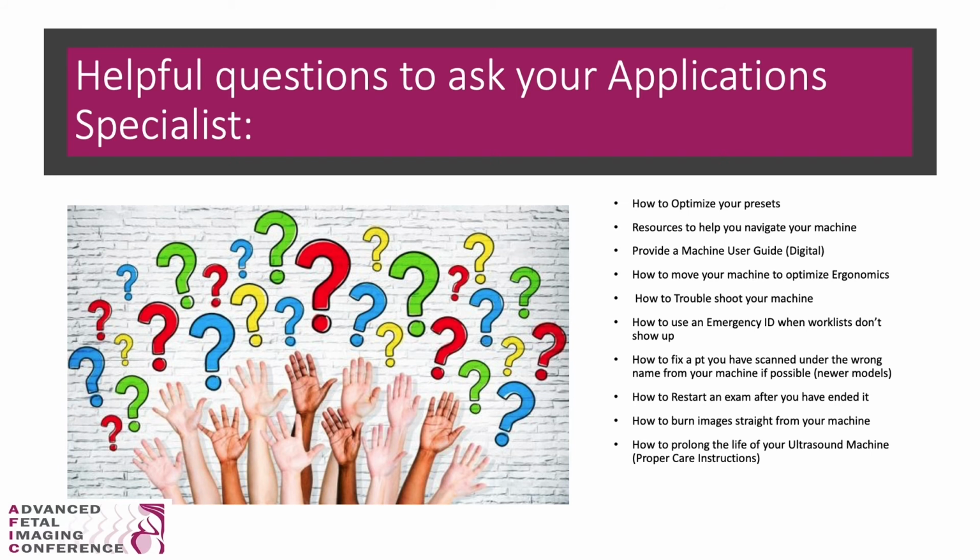Helpful questions include how to optimize your presets, resources to help you navigate your machine, ask to provide a user guide including a hard copy or digital, how to move your machine to optimize your ergonomics, how to troubleshoot your machine, how to use an emergency ID when work lists don't show up, how to fix a patient you have scanned under the wrong name from your machine if possible, usually that's with newer models, how to restart an exam after you have ended it, how to burn images if possible from your machine, and how to prolong the life of your ultrasound machine, including proper care instructions.